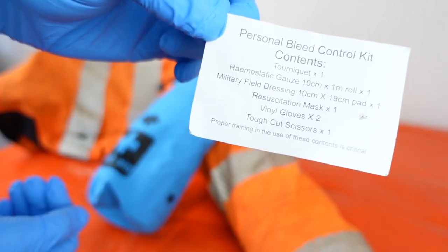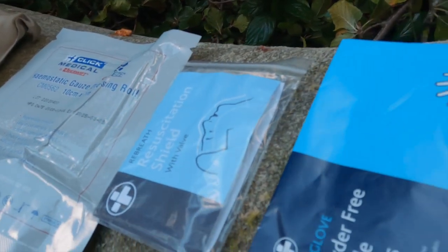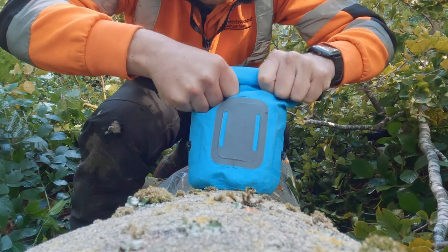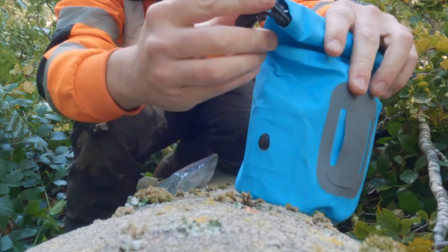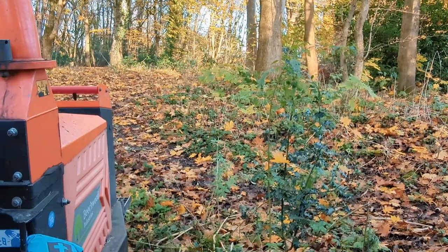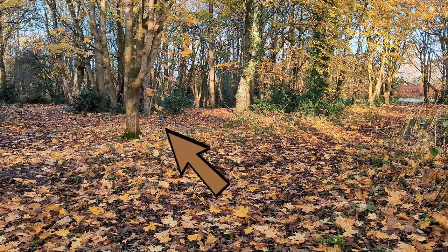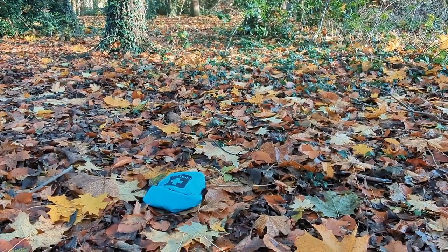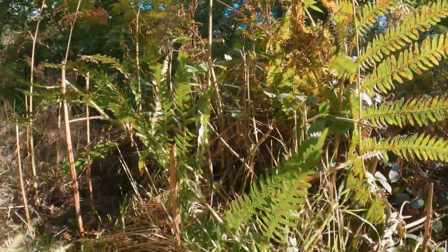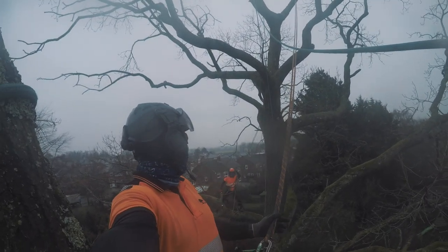Having well thought-out contents is fantastic, however if the pack itself isn't fit for purpose the medical supplies will become perished. The blue kit bag is a small waterproof roll-top bag with a rear belt loop, and access inside is quick thanks to the elastic clip-on sides. I'll need to see how the belt attachment and bag hold up long term, but after a few months it appears compact, robust, and the blue colour can easily be seen. The pack is also available in black and yellow. The team at Native showed me a pack at the APF show that had been worn daily on a climbing harness for two years and still looked in good condition.